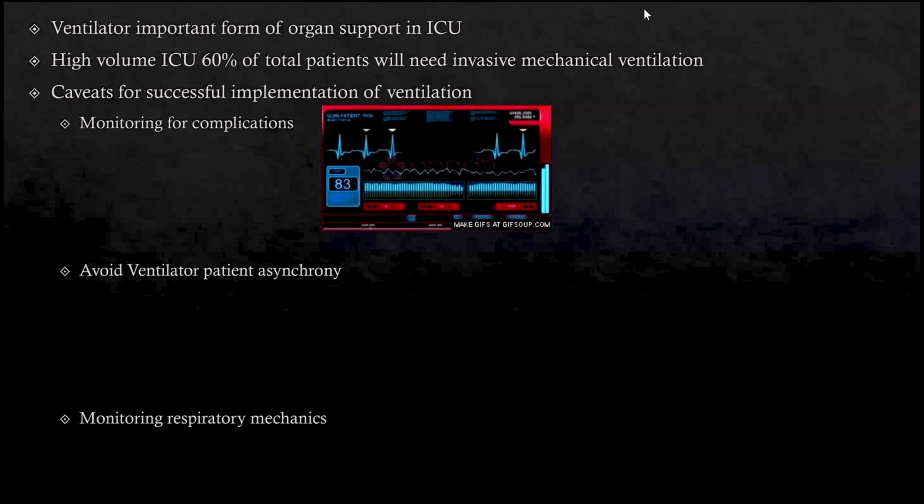It is also important to understand that ventilator manufacturers put a lot of effort into getting these graphics on board. As we are already aware, there are two types of graphic displays: scalars and loops. Scalars are where we look at a variable in relation to time, and loops are in relation to two different variables.